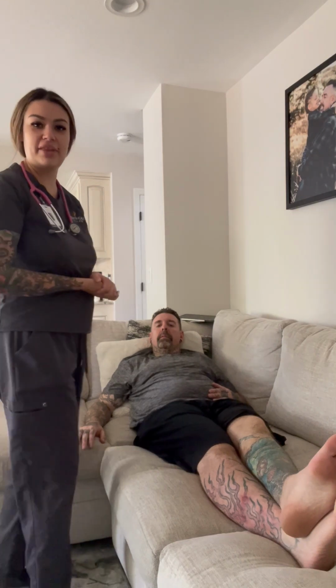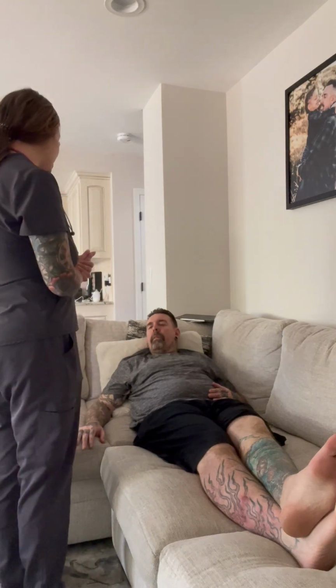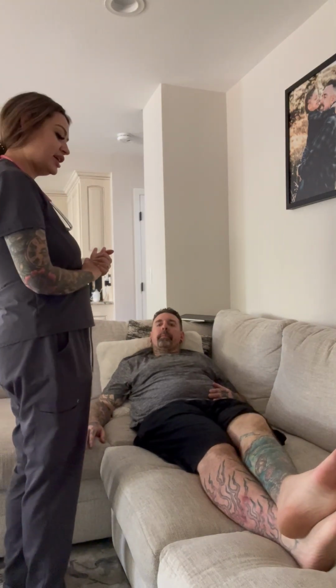I'm going to start by taking the patient's vital signs. We'll do blood pressure, heart rate, respiratory rate, temperature. And then I'm just going to ask the patient if he's in any pain. Are you in any pain today? No. Okay, great. And then I'm just going to start by doing my physical assessment now.